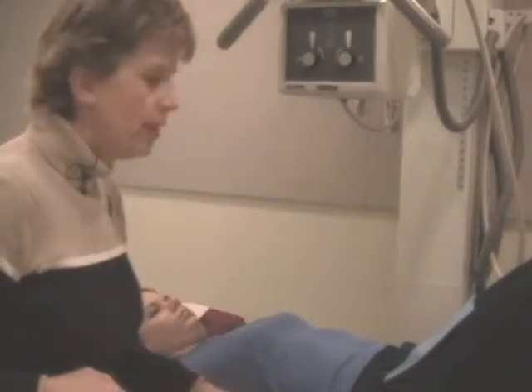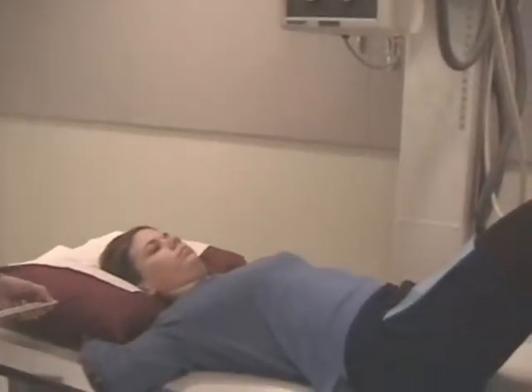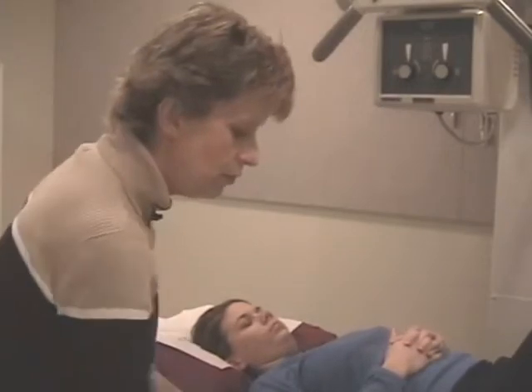Okay, so the patient is positioned. Knees are bent, mid-sagittal planes to the center of the film, and the center of the film is 2 inches above the iliac crest. You can instruct your patient, I'm going to have you take in a deep breath, blow it all out. Please don't breathe, don't move, and you may make your exposure. You're going to want to change films.